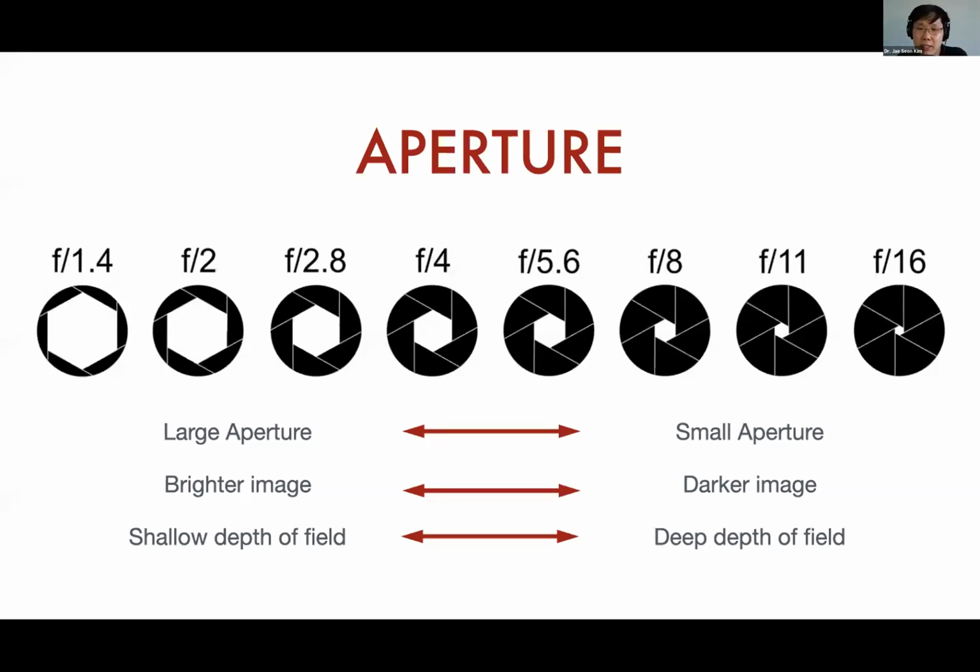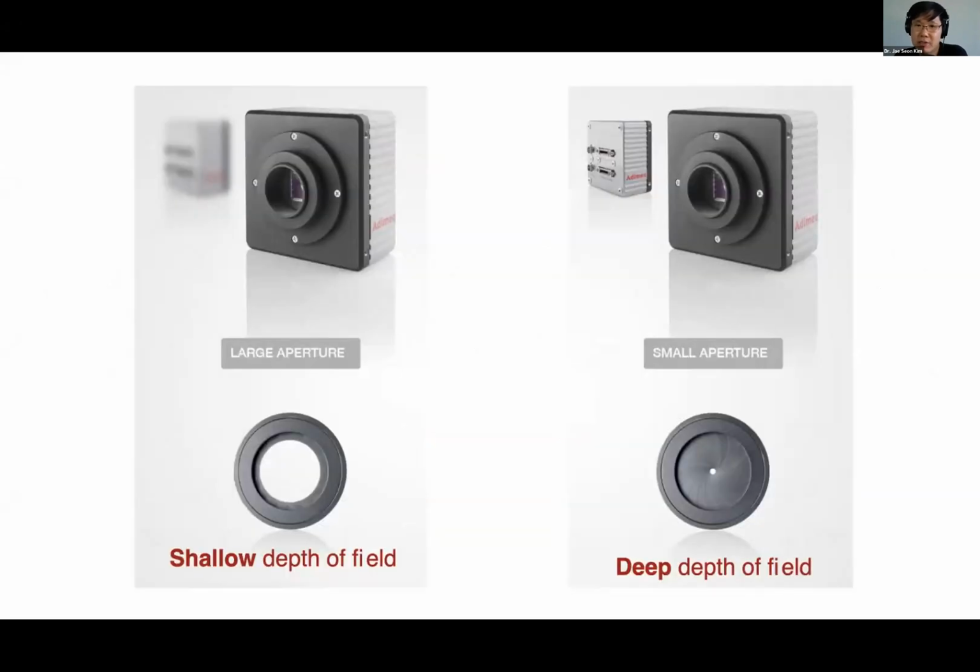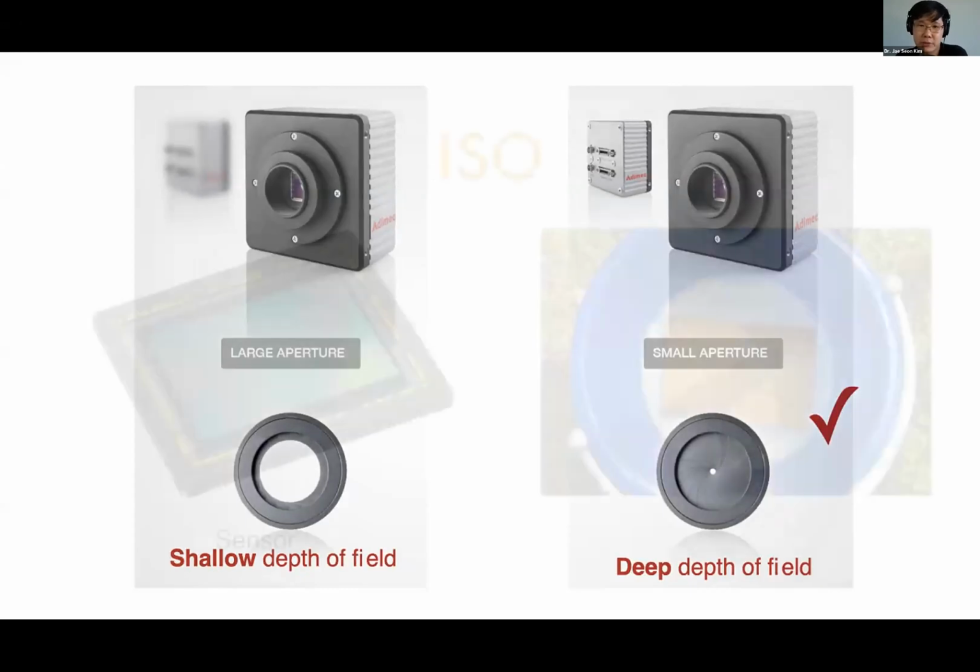And when you take dental photos, if you have a shallow depth of field, that means your central might be in focus, but your canines and premolars in the back are completely out of focus. That is actually very distracting, and you're not trying to create an artistic work in your photography because you're communicating information to your lab. So you want to use an f-stop relatively high so that you can have a deep depth of field, where you want the centrals and the premolars in the background to be in focus.